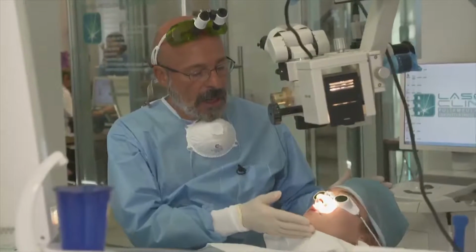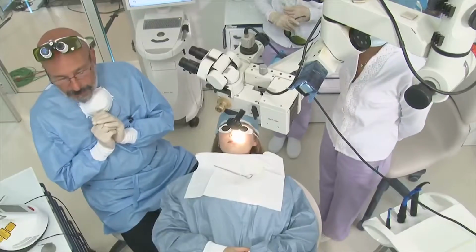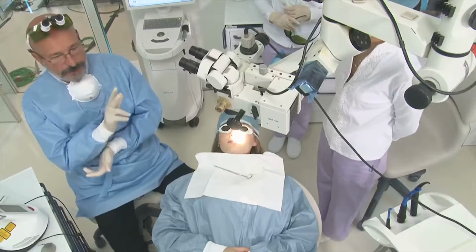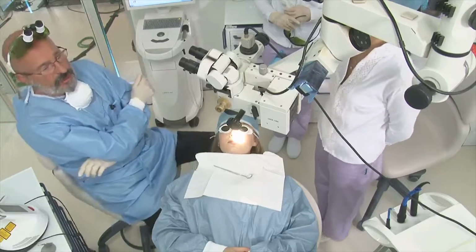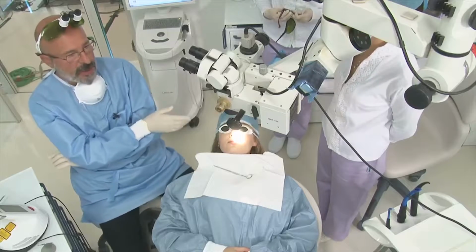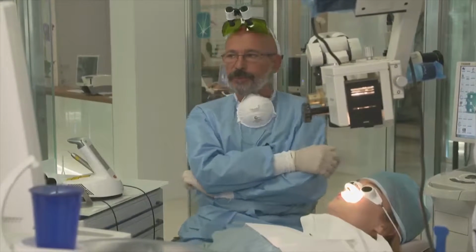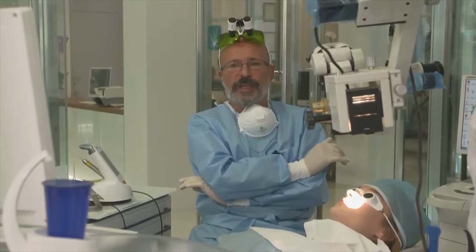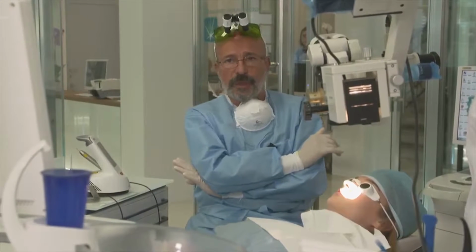But about our treatment, this is a frenectomy, and we are working with this very interesting device. It's very interesting because we can use 3 different wavelengths. The 970 nanometers is useful when we have to treat very fibrous tissue. So if I have to cut, for example, an area in the retromolar area, I prefer to use a 970 nanometer. The 445 is a better wavelength to have the maximum control over bleeding. So in surgery it is the best wavelength on the market for sure.